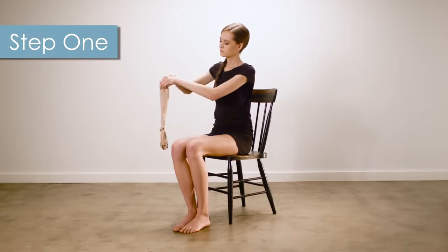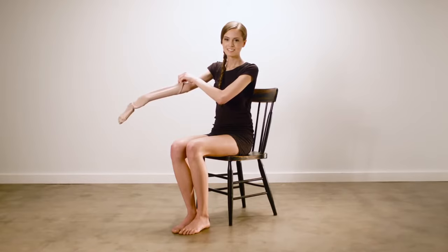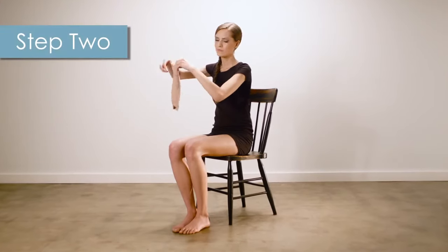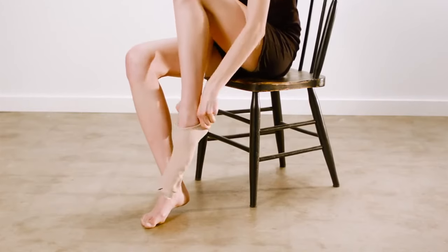Today Brianna will be showing our knee-high stockings. First you want to insert your hand and grab the stocking at the top of the heel pocket like this. While still holding the heel pocket, turn the top of the stocking down toward the toe. Then open the stocking and slide your foot in until your toe and heel are positioned in place.